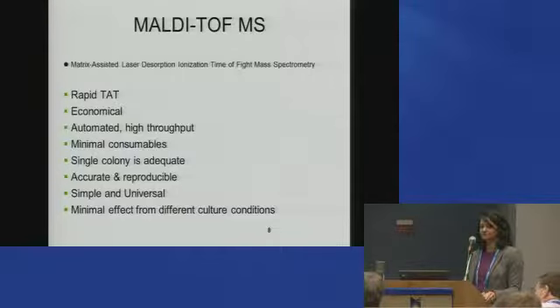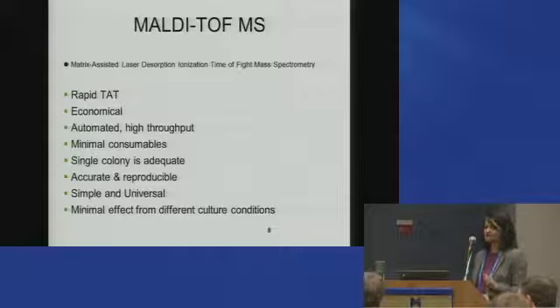And then the other thing, as I mentioned, is that in microbiology we have a lot of different types of culture media that we use to encourage the growth of the organism. And the beauty of MALDI-TOF is it does not care what media you grow your organism on, okay? So you can literally utilize a lot of different media on which to test MALDI-TOF. The only criteria here is, since we're looking at ribosomal proteins, that you have an organism that is relatively fresh, which means less than 24 hours old, on which to do your MALDI-TOF, because you're looking at ribosomal proteins.